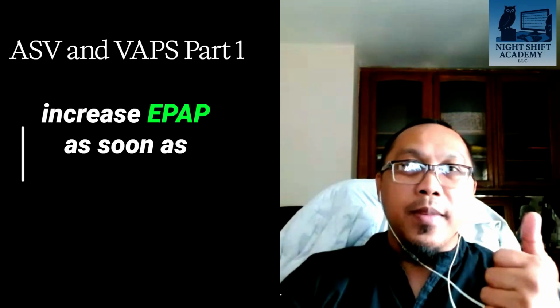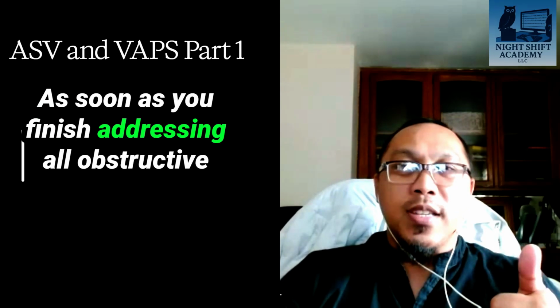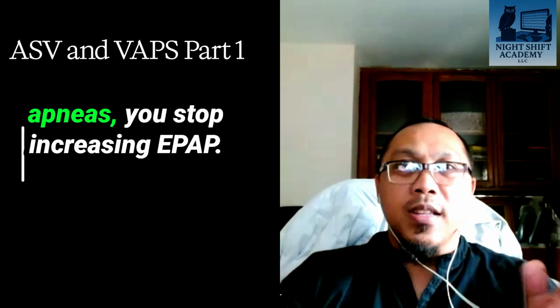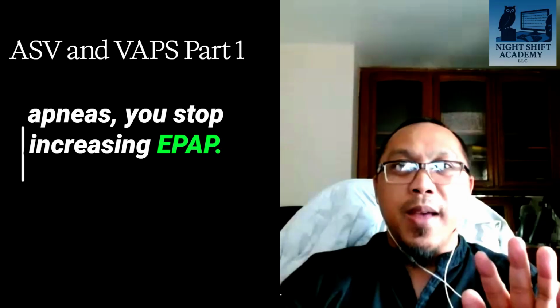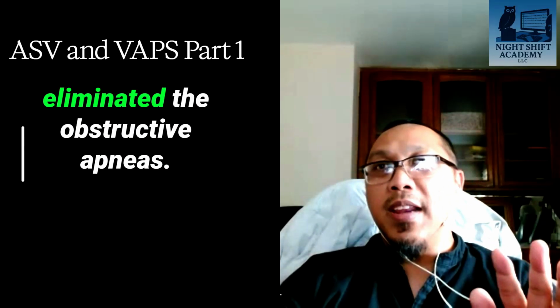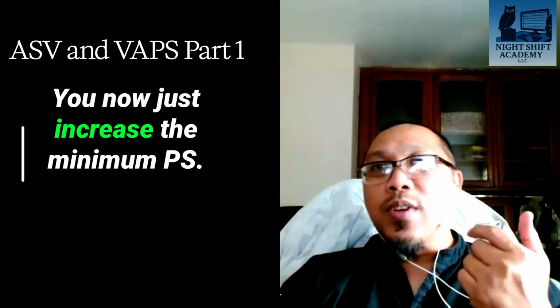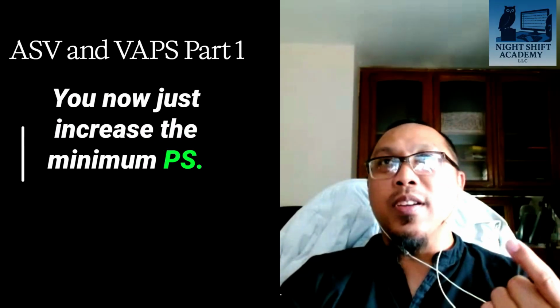When you're titrating on ASV, you only increase EPAP as long as you're seeing obstructive apneas. As soon as you finish addressing all obstructive apneas, you stop increasing EPAP. You never increase EPAP after you eliminate the obstructive apneas. You got it? You now just increase the minimum pressure support.